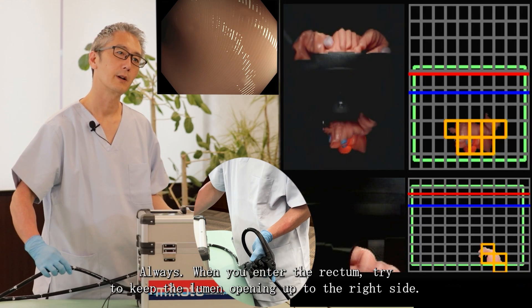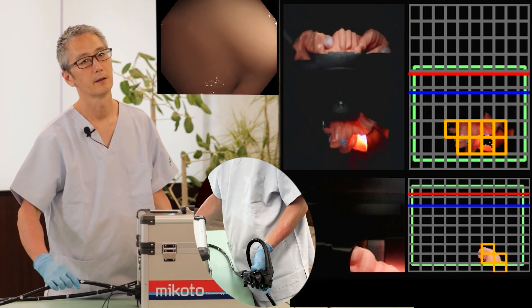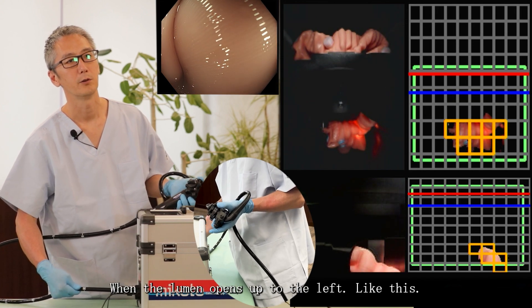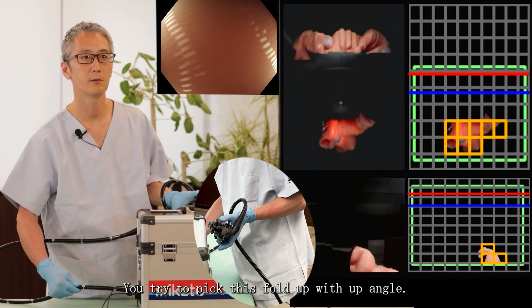Always when you enter the rectum, try to keep the lumen opening up to the right side. When the lumen opens up to the left, try to pick this fold up with up angle.